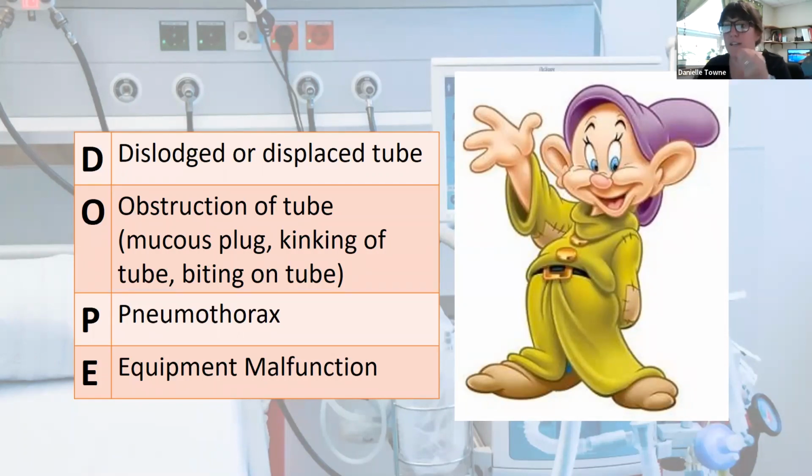And so the vent thinks that there's some type of an obstruction that's causing really high pressure. It can't get past, and it's because the patient's biting on the tube or they're coughing. Consider a mucus plug. Could there be something further down the tube that you can't actually see that could be impeding the easy, smooth airflow? So those are all things that we would need to consider.